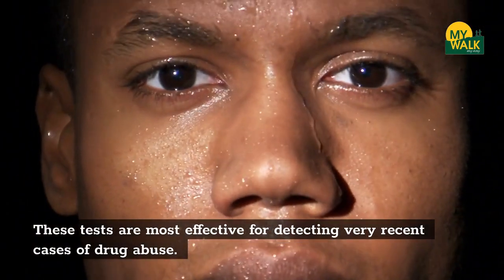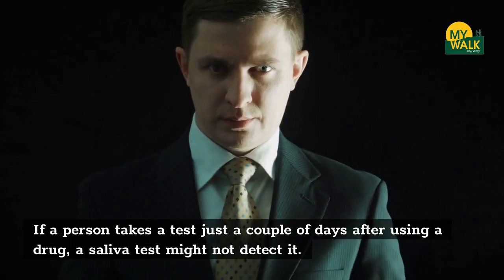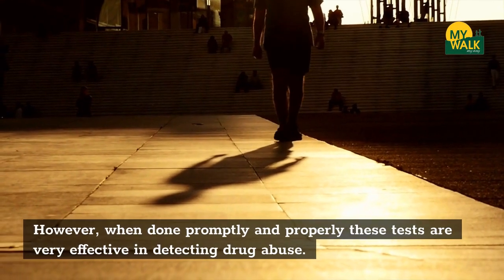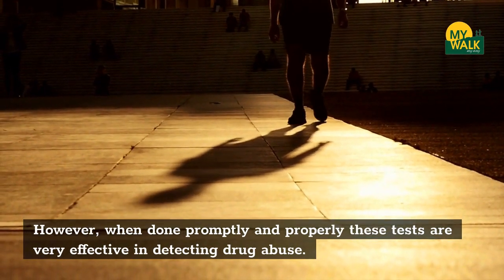These tests are most effective for detecting very recent cases of drug abuse. If a person takes a test just a couple of days after using a drug, a saliva test might not detect it. However, when done promptly and properly, these tests are very effective in detecting drug abuse.